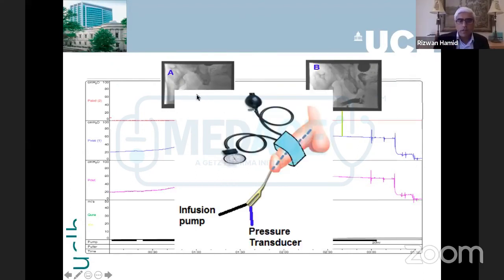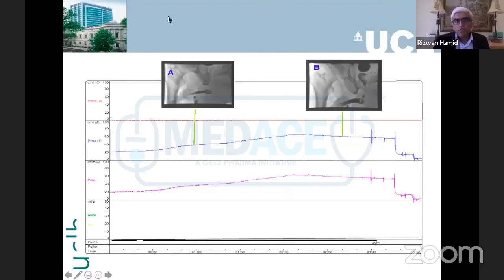Again, what is the urodynamic question? And as you fill up, you can see nothing is going beyond and the pressure is going up, up, up. It goes up to about 50 centimeters and then starts to come down because now the fluid has gone past. That means that is the artificial sphincter resistance, or the resistance offered by the external sphincter. So in this case, he had an artificial sphincter, and it can hold against a pressure of 60 centimeters of water, which by and large is quite good because normally when we put a cuff it is between 61 to 70 centimeters of water.